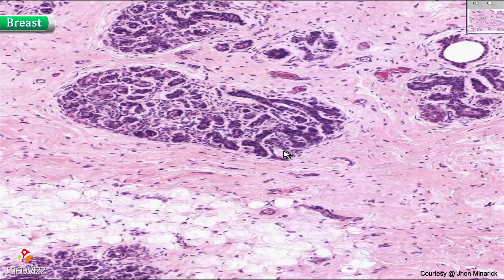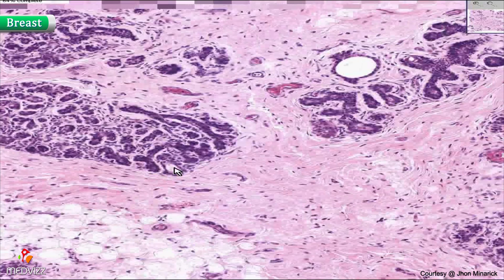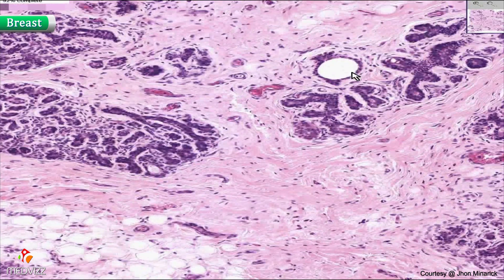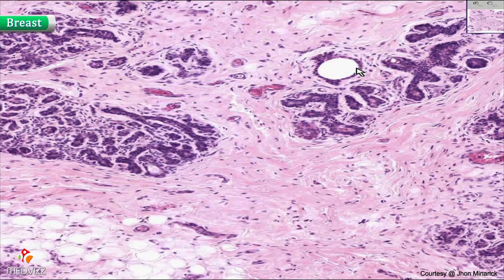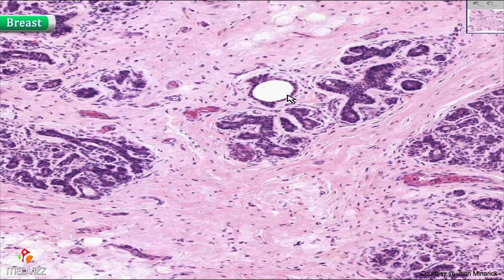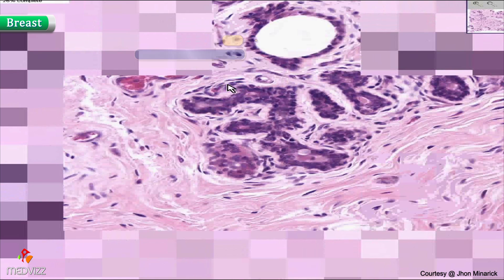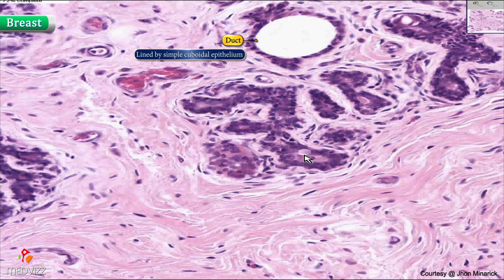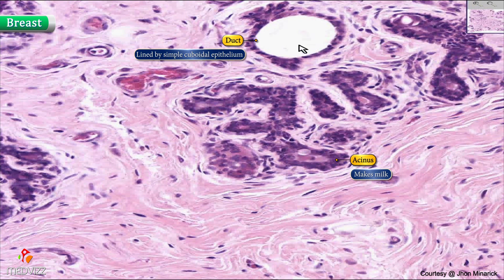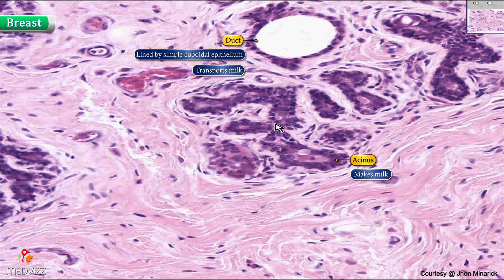Sometimes if you see a structure like this, which is strictly lined by perhaps a simple cuboidal type of epithelium, you know that this is a duct. And if you see an area like this, this is an acinus. The acinus makes the milk, and the ducts — whether they're intralobular or extralobular — just transport the milk.